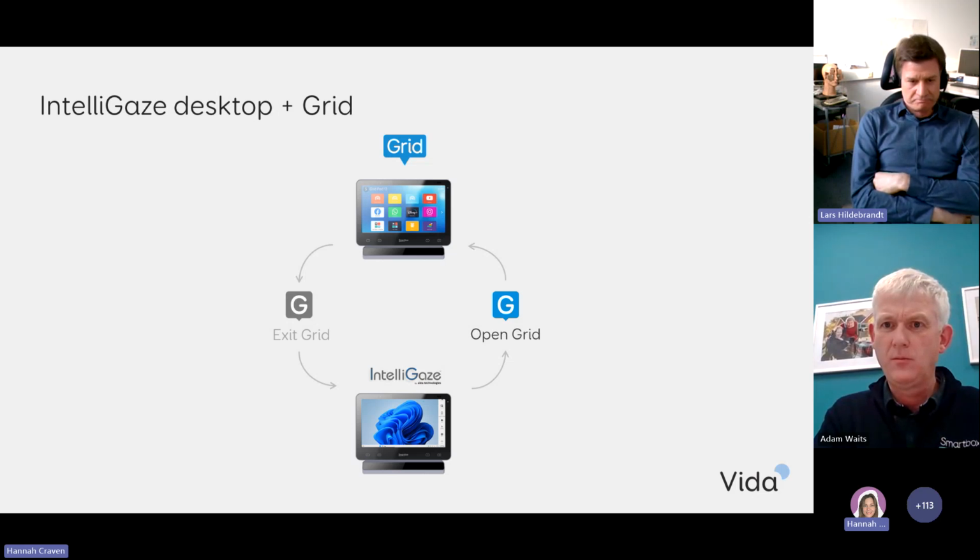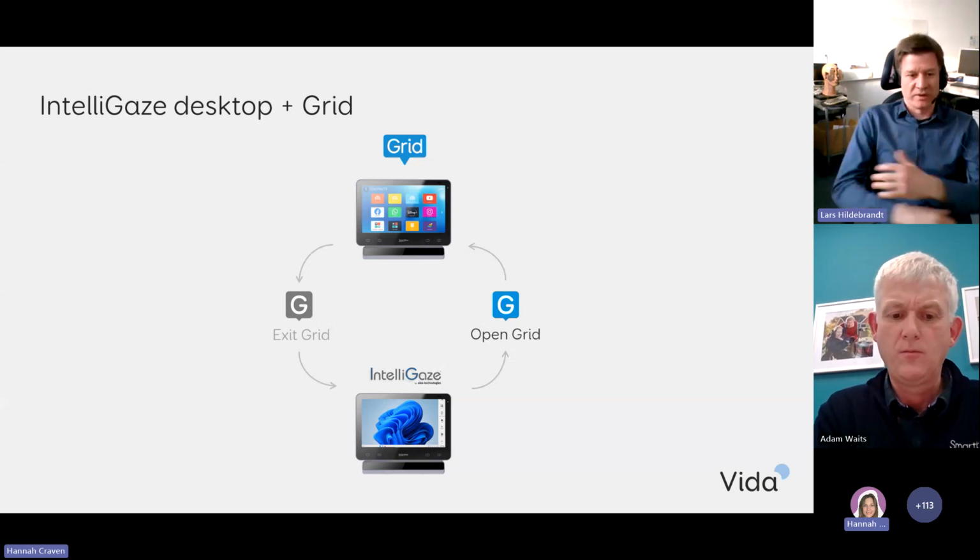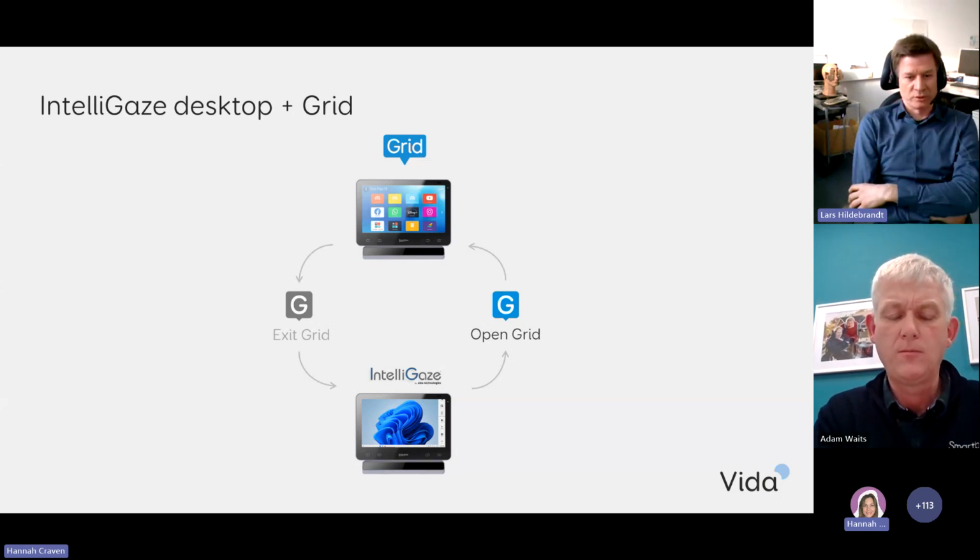And this you can repeat as often as you want. So if you configured your grid pad as shown on the previous slide, then not just the caretaker, but the user itself can switch between both worlds and use the benefits of both worlds whenever he or she wants to.